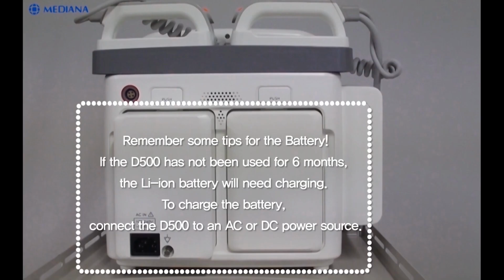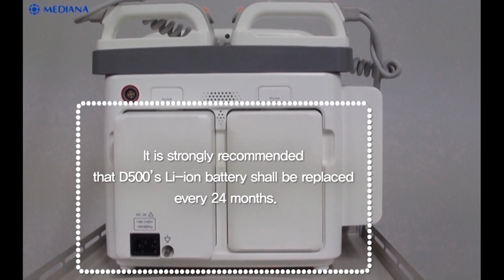And please remember some tips for the battery. If the D500 has not been used for 6 months, the lithium-ion battery will need charging. To charge the battery, connect the D500 to an AC or DC power source. It is strongly recommended that D500's lithium-ion battery shall be replaced every 24 months.